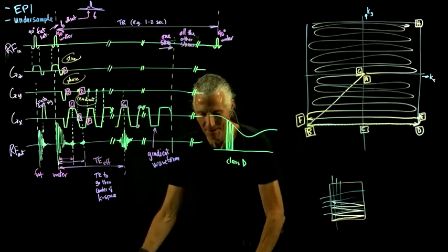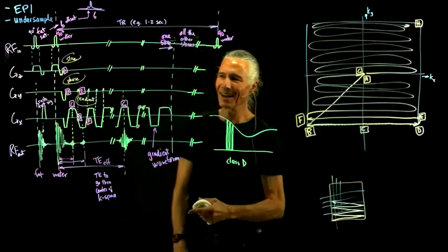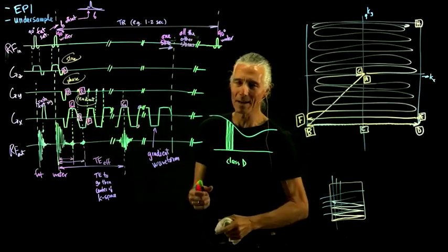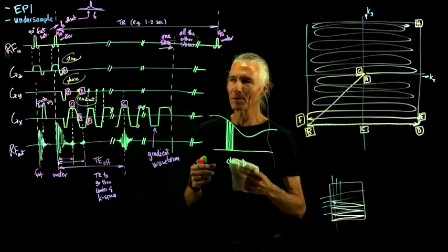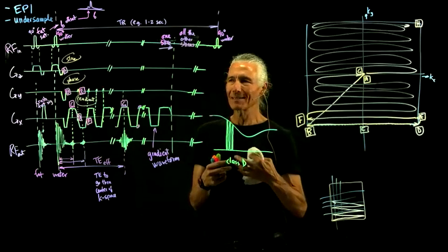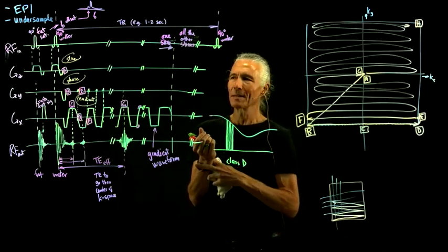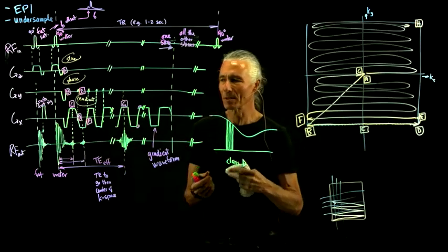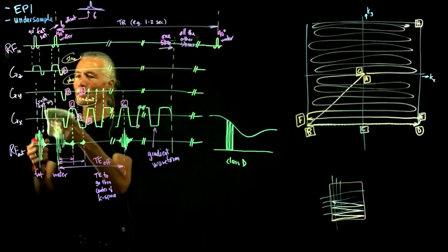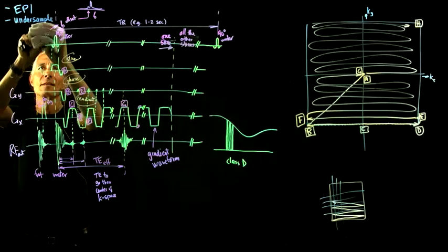Okay. So we haven't talked about speeding this up even further, and so that's for Friday. Almost all the time people are doing something called multiband now, where you record multiple slices at once. So we'll talk about that. That's like the ultimate speed up. We'll talk about how that works, but in order to understand how that works, we have to understand about undersampling.